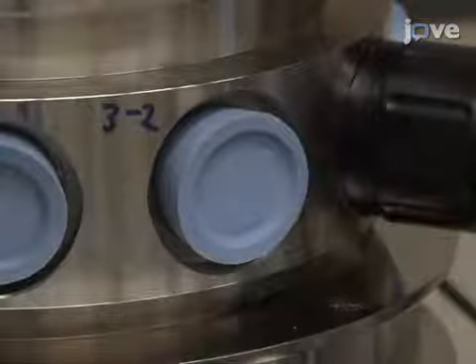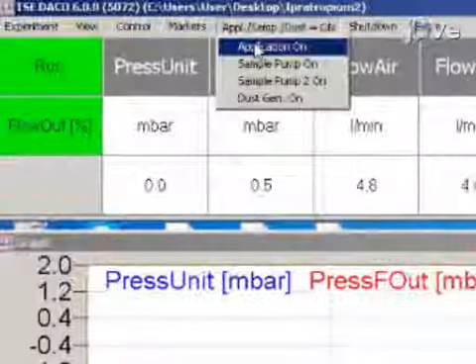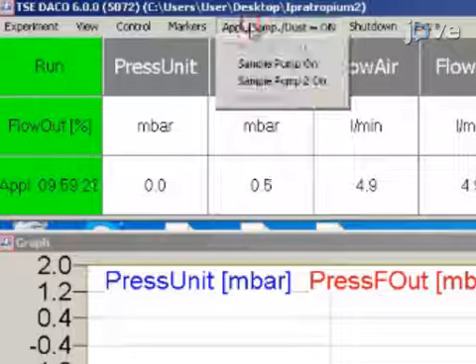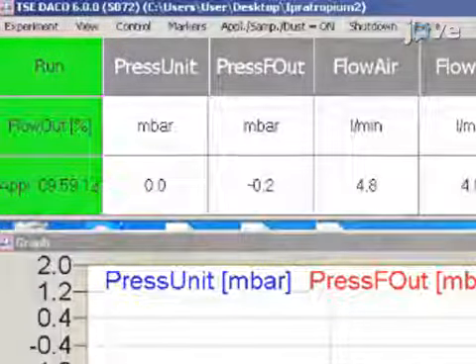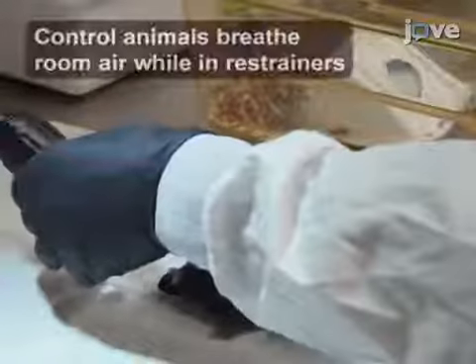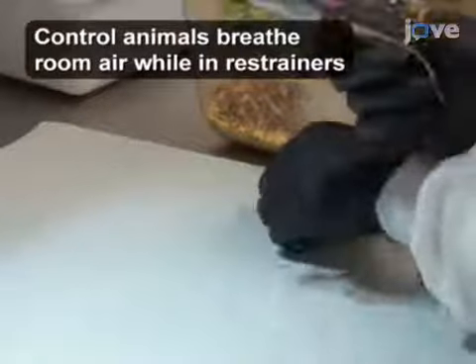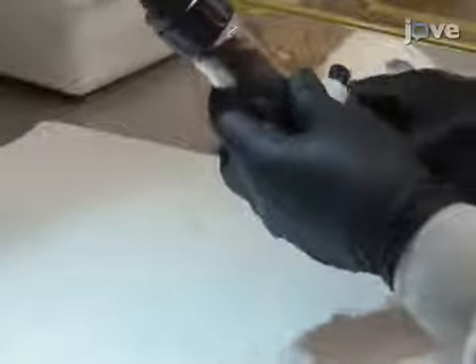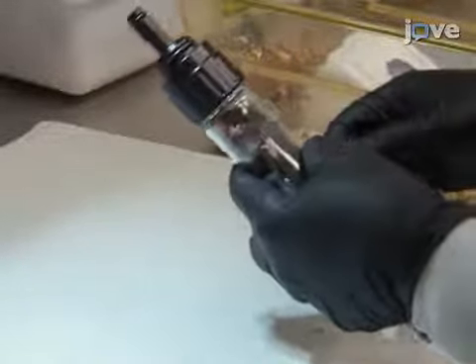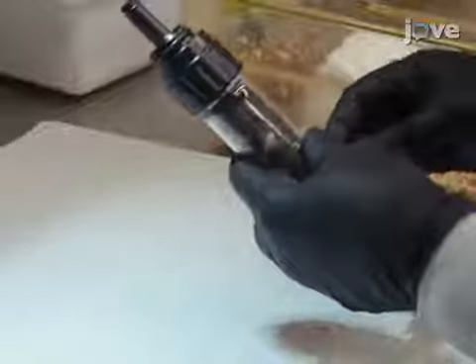Plug the delivery ports of the inhalation unit with stoppers and activate the aerosol generator, the compressed airflow controller, and the inhalation unit vacuum pump from within the process control software. Now load the experimental mice into the nose-only restrainers, angling the restraining tubes up towards the ceiling as the animals tend to run upward during the loading process, with the noses in the pointed ends of the tubes.